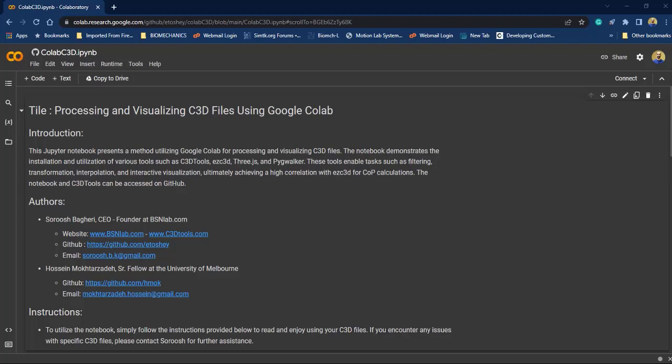Hello, I'm Surush and in this video I want to show you how you can use Google Colab to read and visualize your C3D data and finally export your data as a readable file such as ASCII file, TRC, and MOT for OpenSim users.